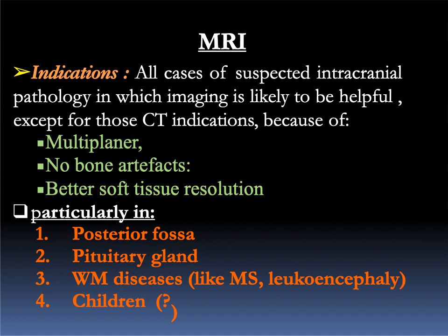Particularly in the posterior fossa. The pituitary gland has very high resolution on MRI, and for any white matter disease MRI is the best.